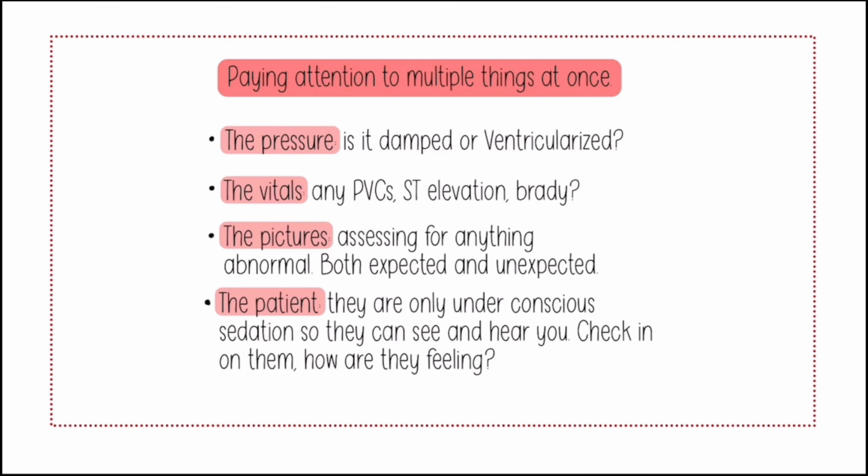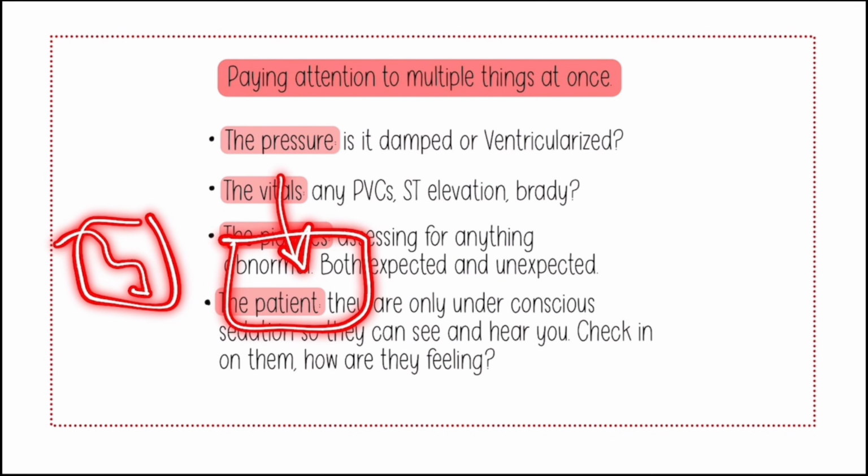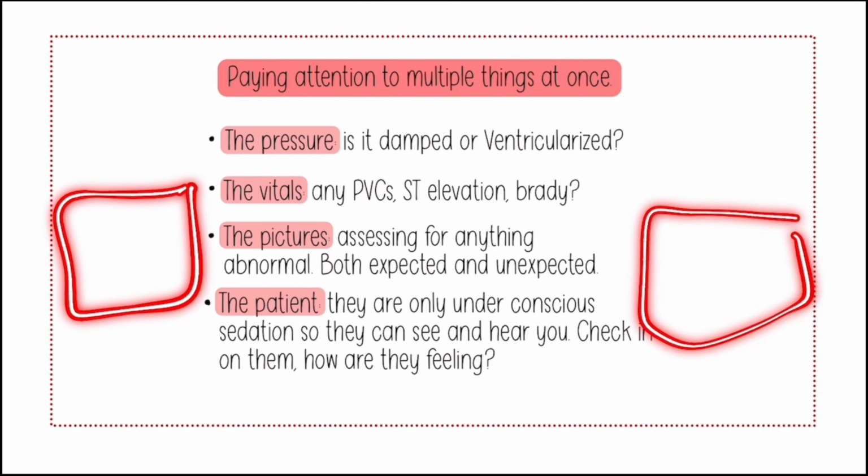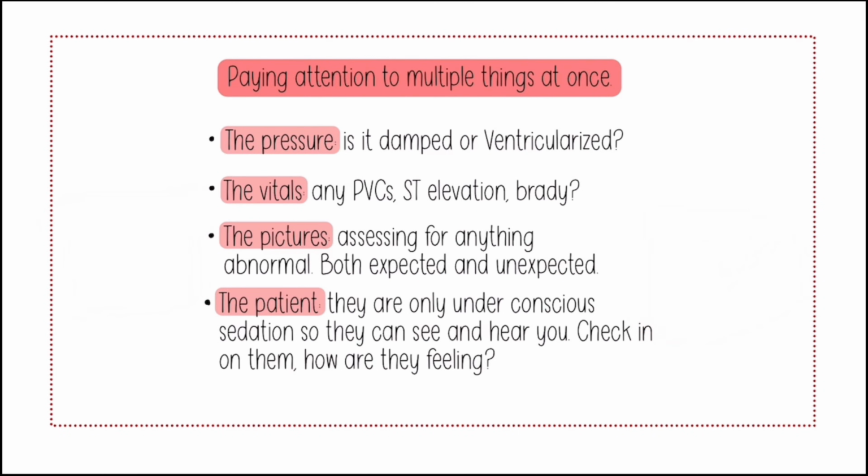There's multiple people in a room, and everybody has different roles, right? So the monitor person who is not actively scrubbed in, they might just be documenting, but their number one thing is to pay attention to the vitals, because that's the monitor. They're looking at the monitor. Everybody in the room should be looking at the vitals, but you might be, let's say, preparing a device and paying attention to the device going into the coronary artery, and you're not fully paying attention to this vital screen, but the person in the monitoring room should only be paying attention to that monitoring screen. So while you're doing this, you know someone else is paying attention to that.